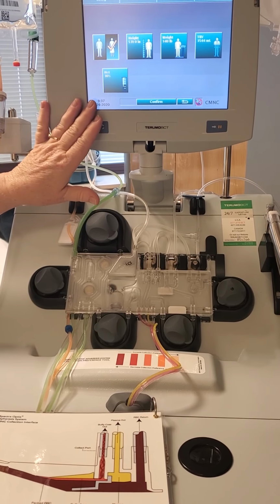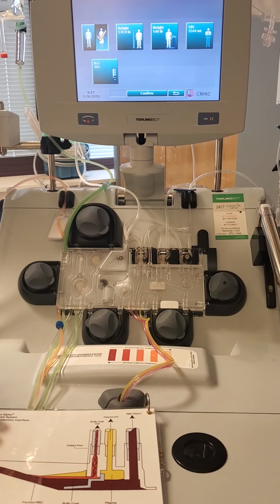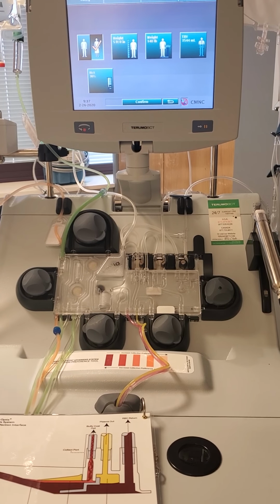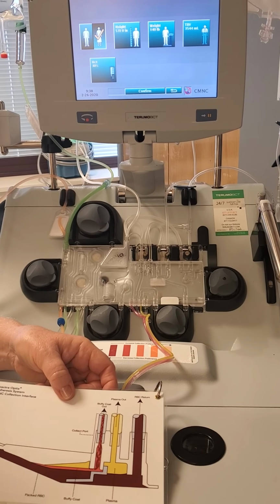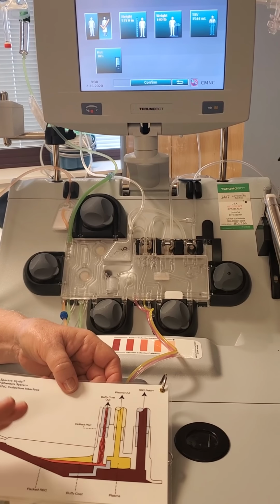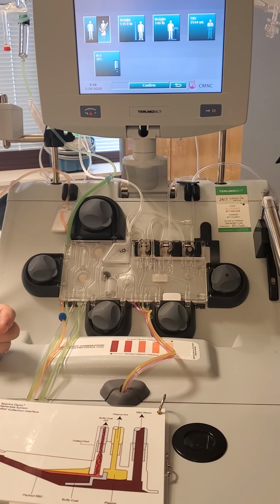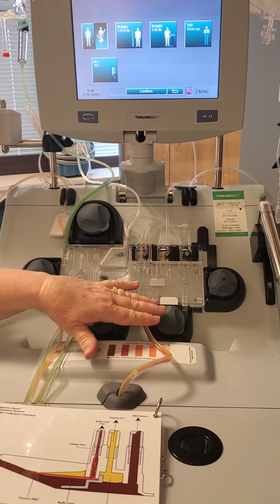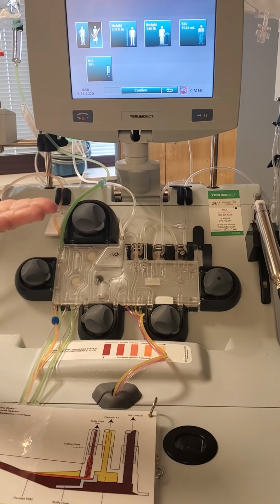But in this case, when our hematocrit is too high and the red cell layer is way too low, we're going to decrease the crit by 3. This is the opposite of spillover. Spillover was red cell layer too high. We increase the crit by 3. That tells the machine there is less plasma, so it slows the pump and tamps down the red cell layer. In this instance, AIM can't even get that red cell layer up to the appropriate level. So we will decrease the hematocrit, which tells the machine there's more incoming plasma, speeds up the plasma pump, pulls it out, and the red cell layer rises up.